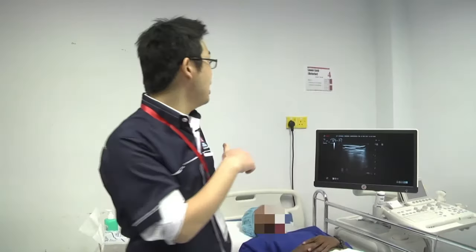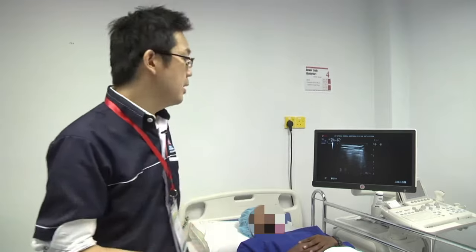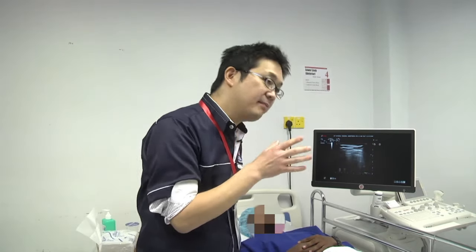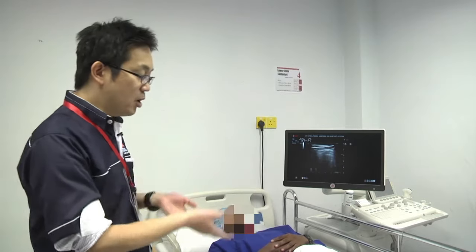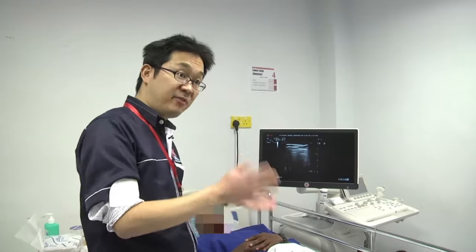In this session, I'm going to talk about obturator canal block and the adductor canal block. There are many approaches for obturator canal block, but they can be classified into distal or proximal approaches. I'm going to talk about distal approach first.